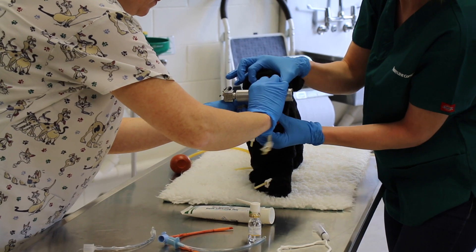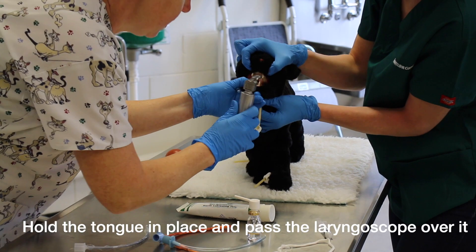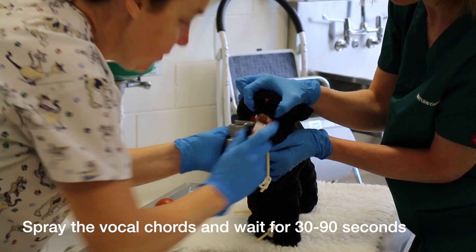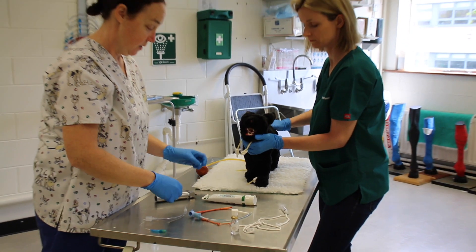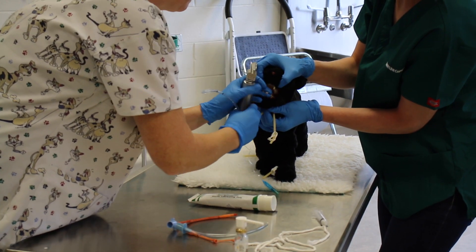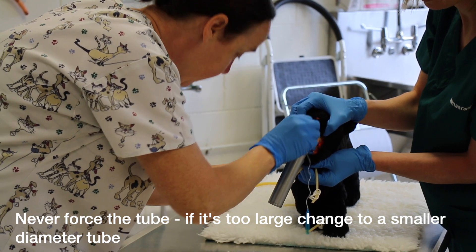Now I'm going to open the patient's mouth and pull the tongue forward between the canines. With the laryngoscope, place it on the back of the tongue to visualize the vocal folds. Use the local anesthetic spray on the vocal folds and leave it for 30 to 90 seconds — in an OSCE setting, we proceed more quickly. We take the laryngoscope and the ET tube, hold the tongue, use the laryngoscope to visualize, and thread the ET tube down the laryngoscope blade and into the patient.